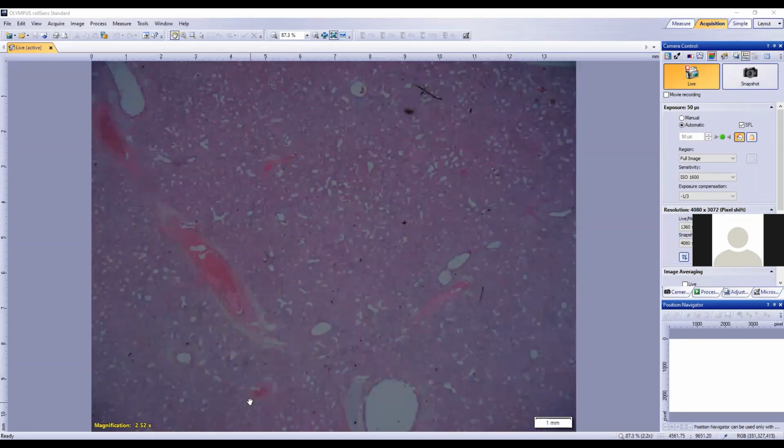Hyaline membranes, and the pathophysiology that you've described, suggest a particular type of process. So are they more commonly associated with an acute lung or chronic pneumonia? Diffuse alveolar damage, and acute, absolutely, Penny. Acute. So what processes would we be thinking of? What underlying causes would we be thinking of if there were hyaline membranes all through the lung?